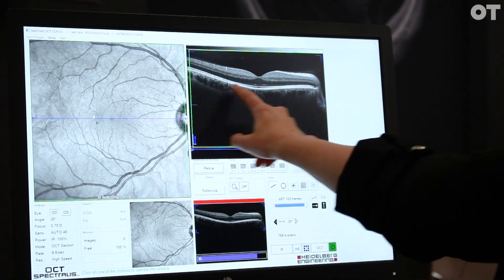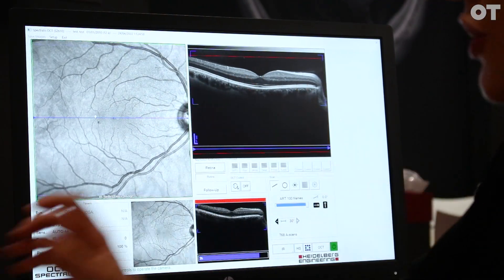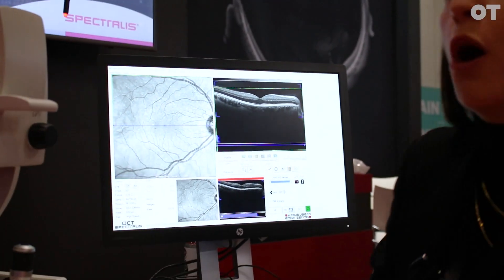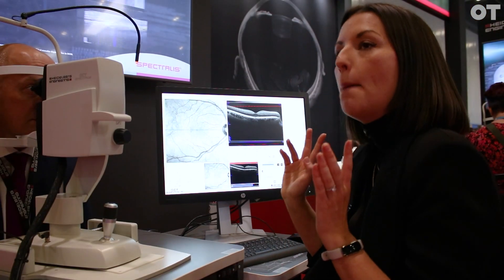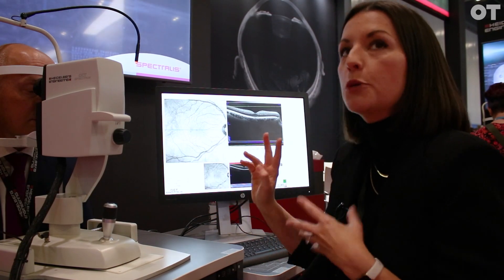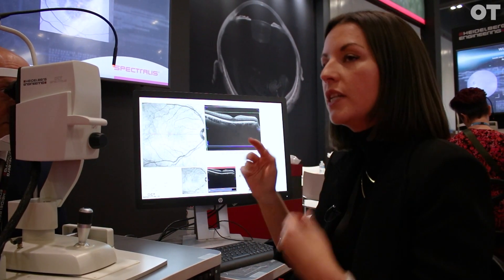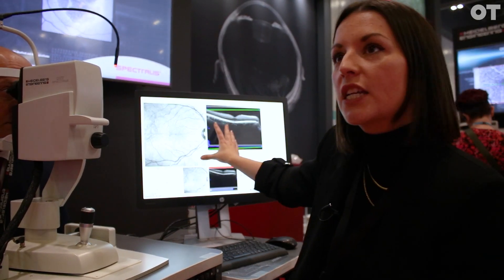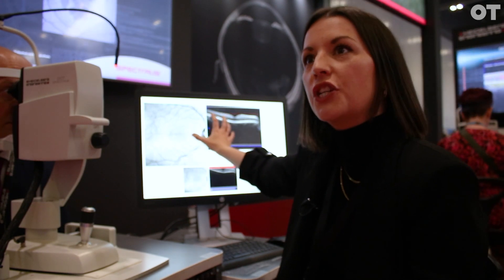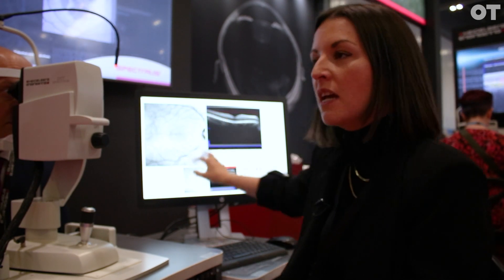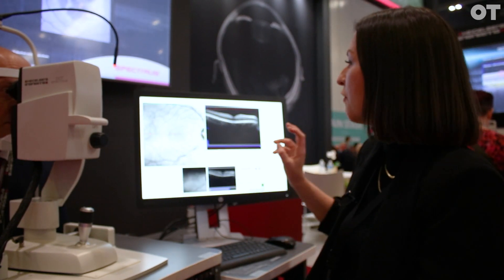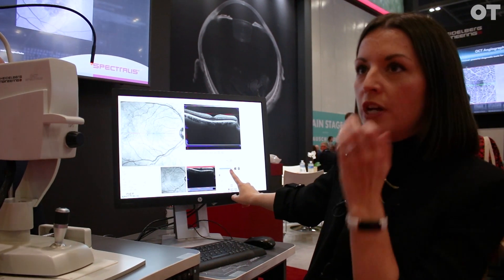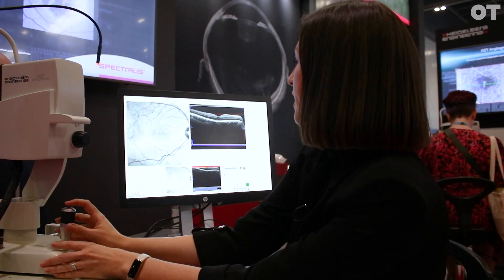You can see we've got this green box now — the eye is still moving — but up here I still have a really nice high-quality image. If I just click now I'm acquiring that image. I don't need to worry about blinks, eye movement, or the head tilting, because the eye tracking is working and it's locked that image onto the screen.